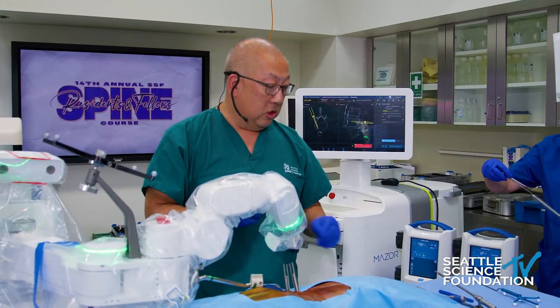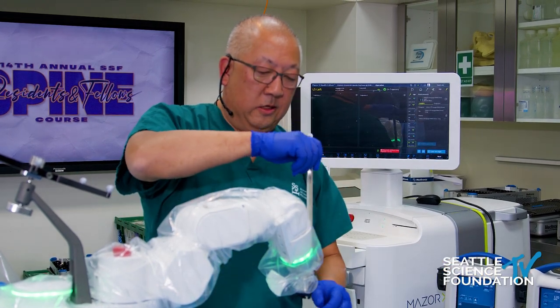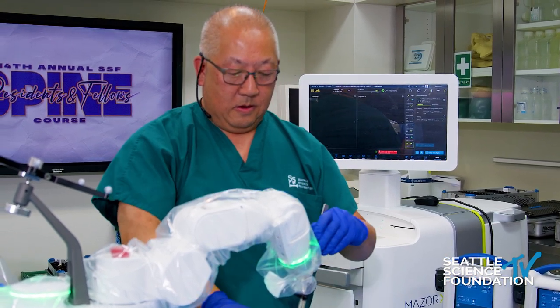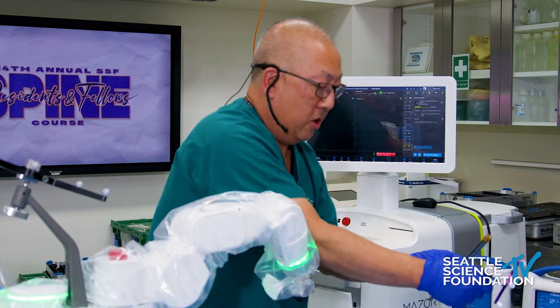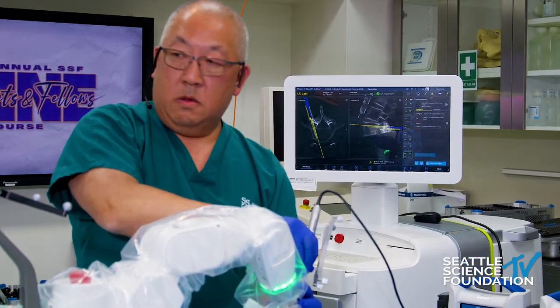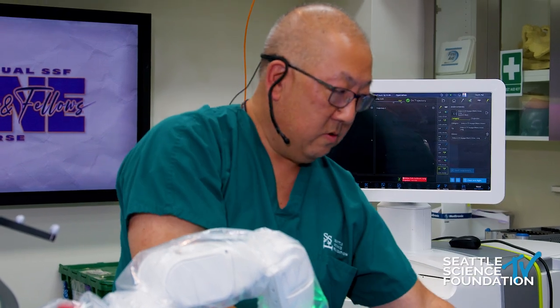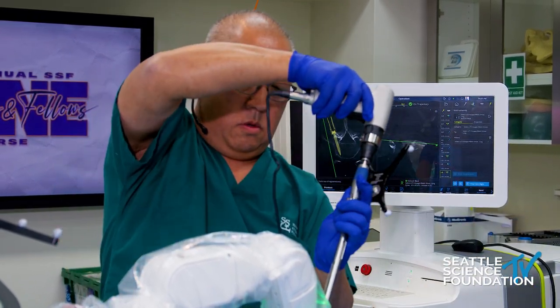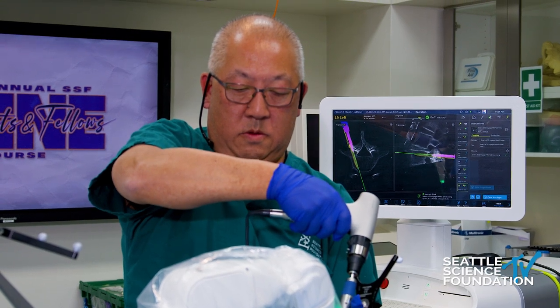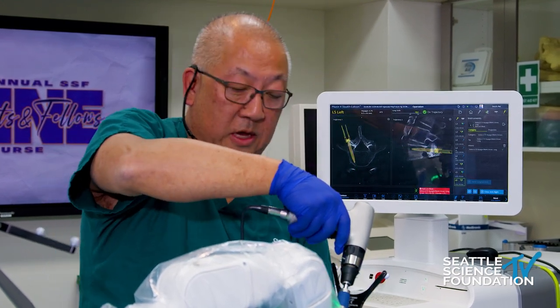We'll make the incision first. This time we're going to go in with the cannula and the drill together in one step, drill the hole, take everything out, and then drop the screw. And so there's a pedicle screw being placed with a robot in two steps.